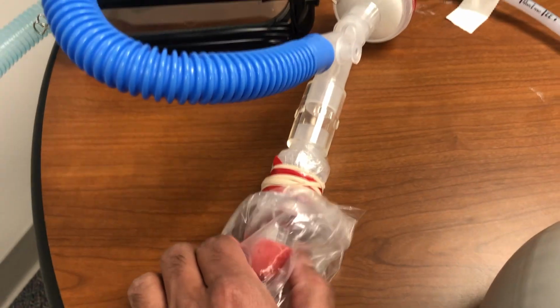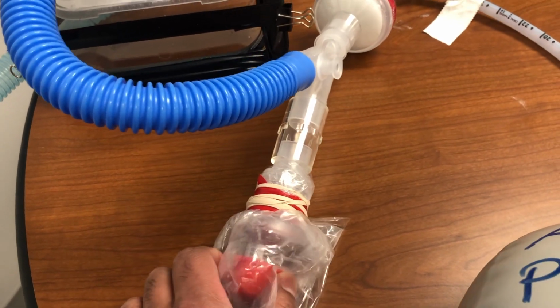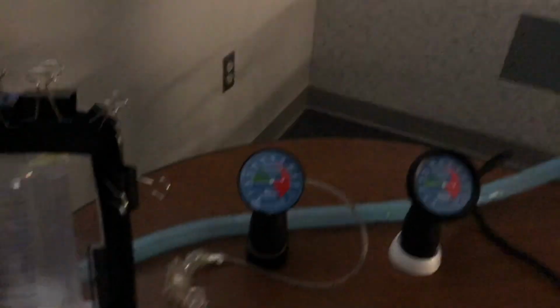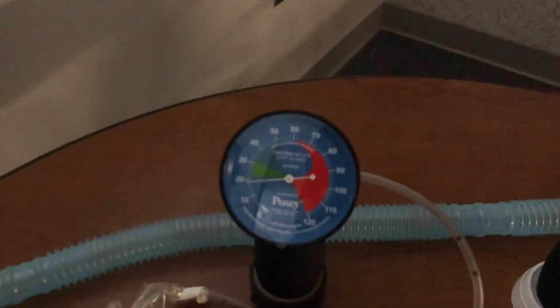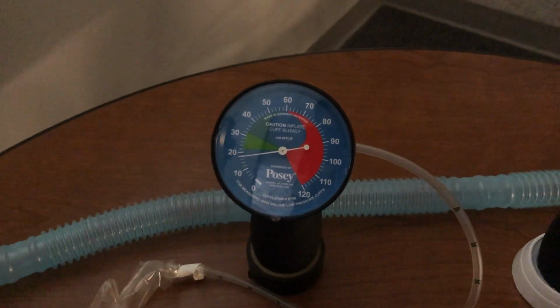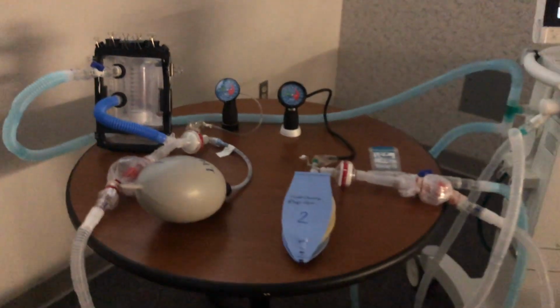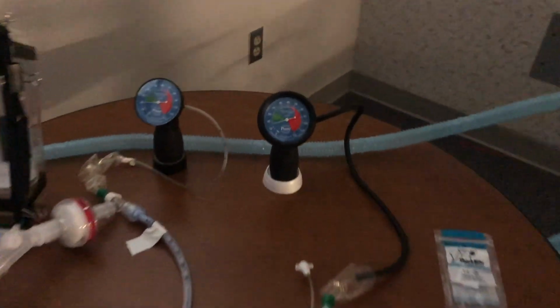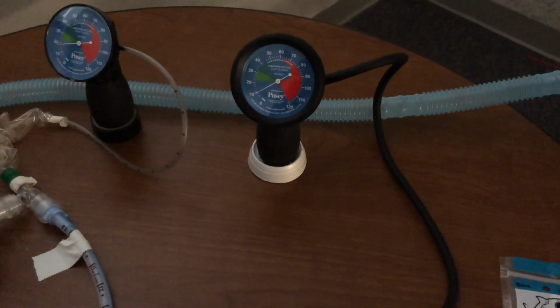Okay, I think I have to use my... yep, here we go. So I have changed the PEEP here to much higher, to around 18. Thus we see that we can change the patient's PEEP and volume or pressure without changing the pressure on any other patient basically.